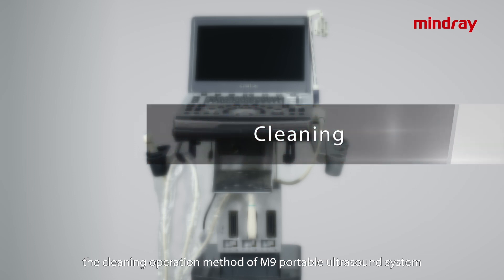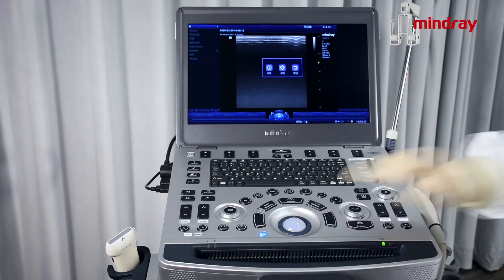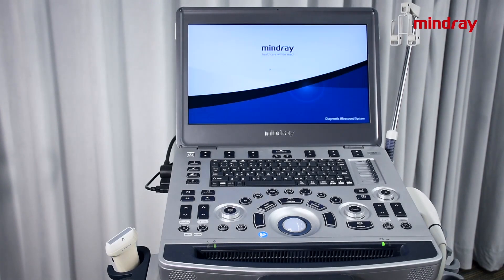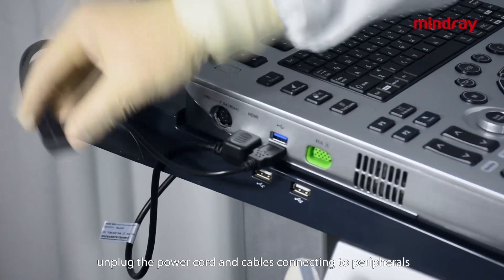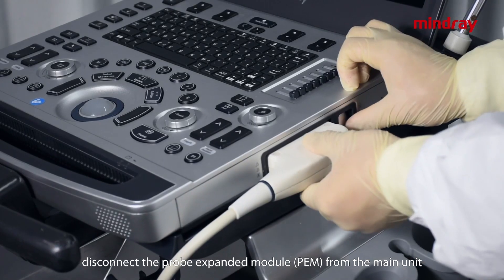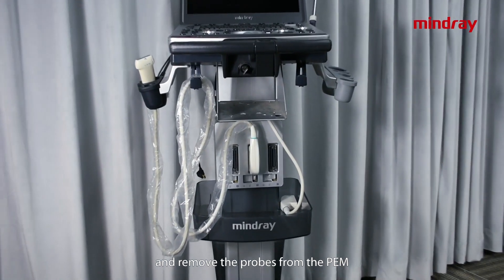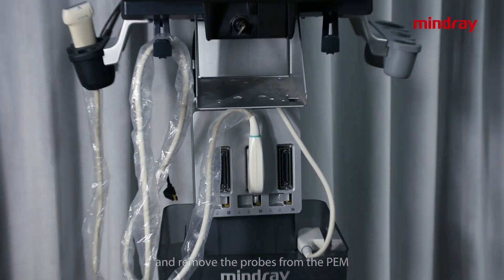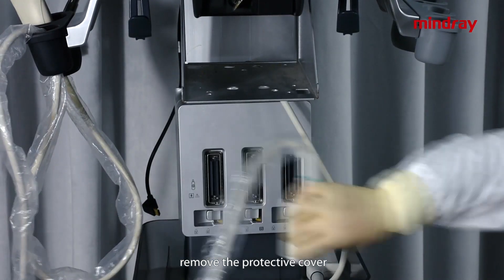The following will demonstrate the cleaning operation method of the M9 portable ultrasound system. To begin cleaning, turn off the machine, unplug the power cord and cables connecting to peripherals, and disconnect the probe extended module control from the main unit.